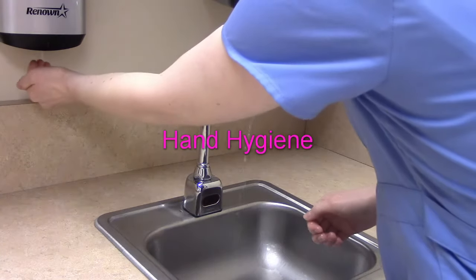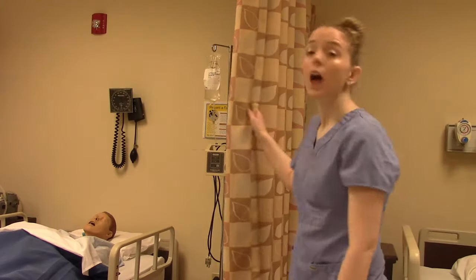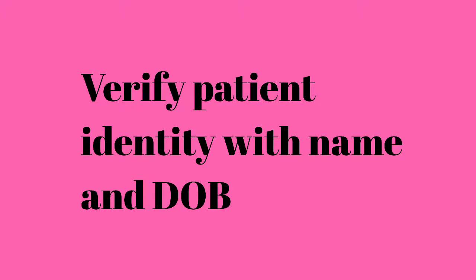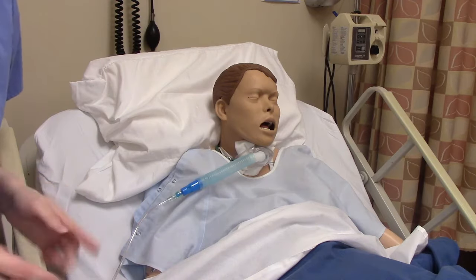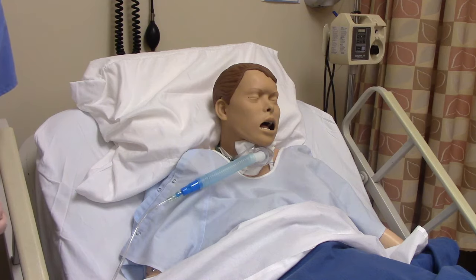We wash our hands and provide patient privacy. We've washed our hands, we've provided privacy, and we've identified our patient using name and date of birth. Now we're going to suction their trach.